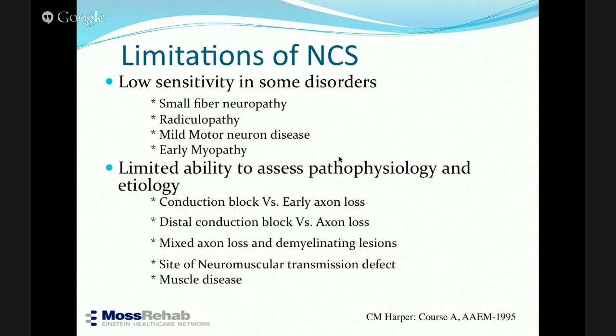It will take a little bit of time, when Wallerian degeneration is complete and the response starts becoming smaller, and that would give you pieces of information about conduction block versus axon loss. So it can tell you about distal conduction block versus axon loss.